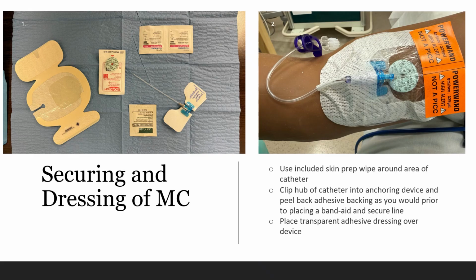So we're at that point where we're positive the catheter is in the appropriate place. It's protruding from the skin. We've cleaned up all that excess gel, ready to put our biopatch down. There could be some variations depending on what your kit contents are. But on this photo that's done in our sim lab, these are some of the contents you may see.